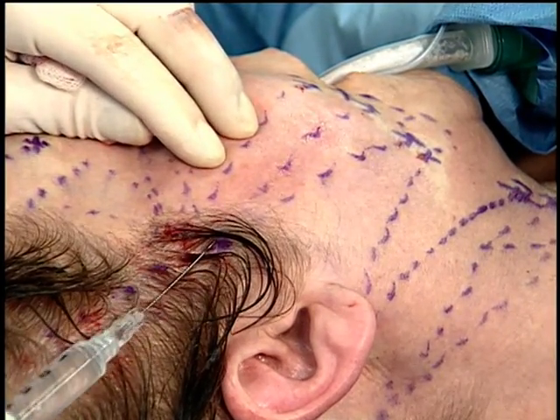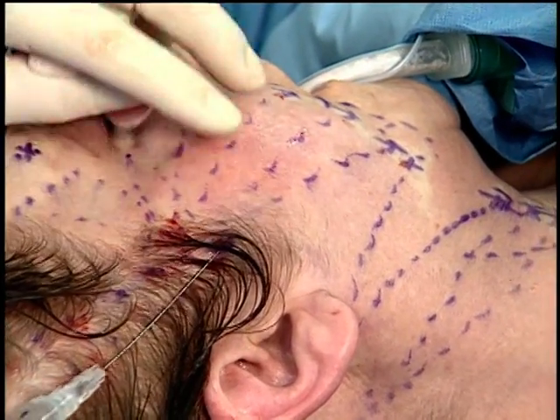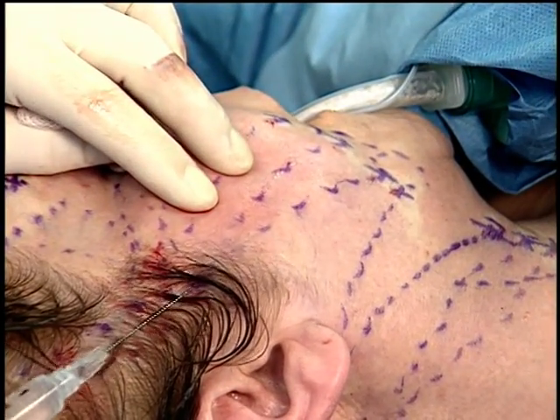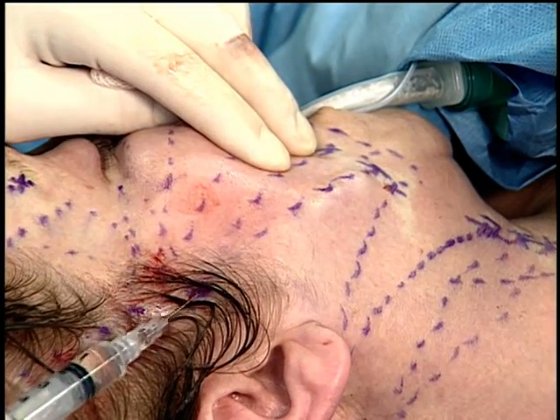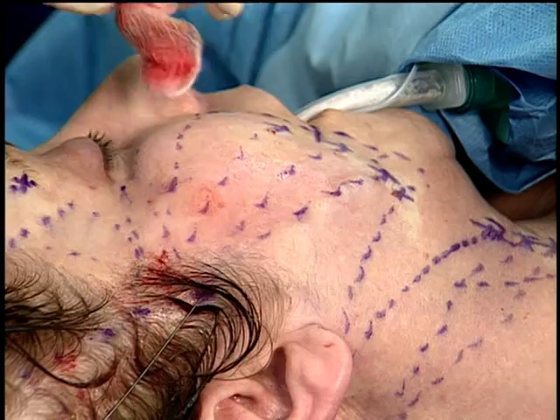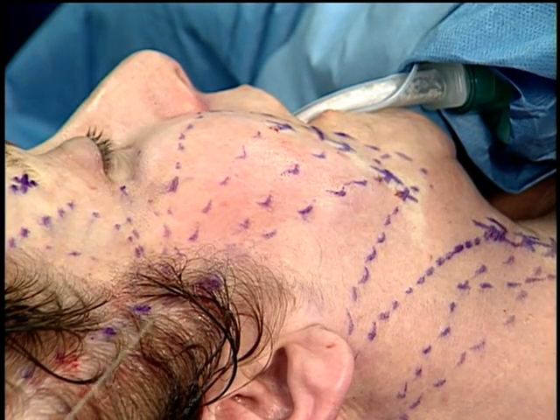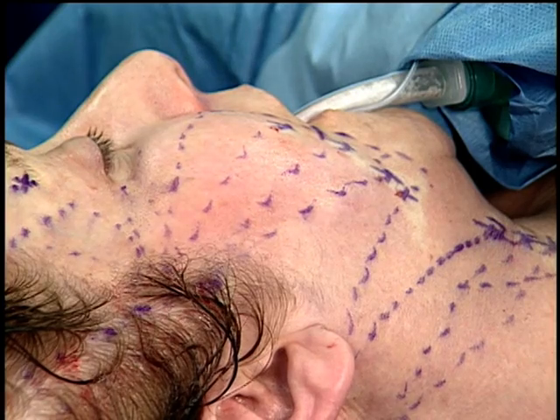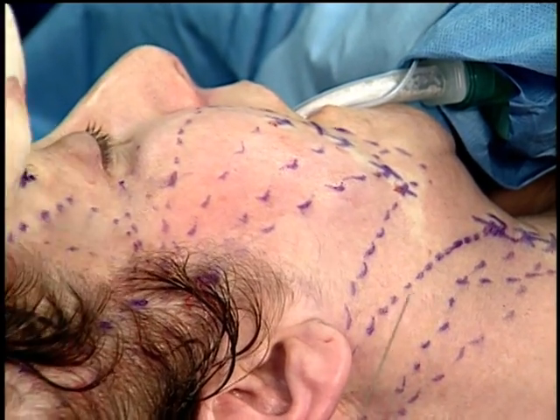If you hydrodissect with your local in the fat plane where you need to be, 3 to 4 millimeters deep, your deployment will become very, very easy because you've already created the right plane for your needle. We'll talk about the depth of deployment, but you want about 3 to 4 millimeters, even 5 millimeters of fat under the dermis, as you would for a facelift flap if you were elevating it in the face.